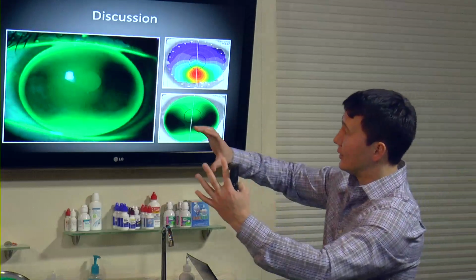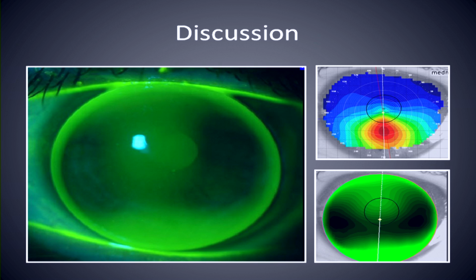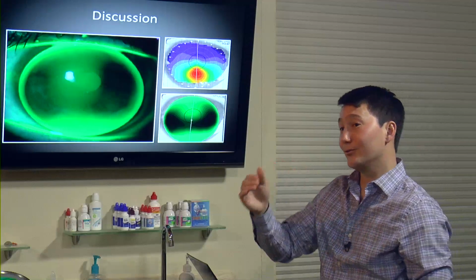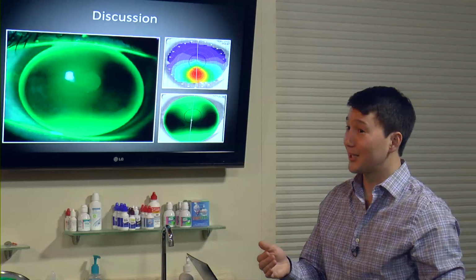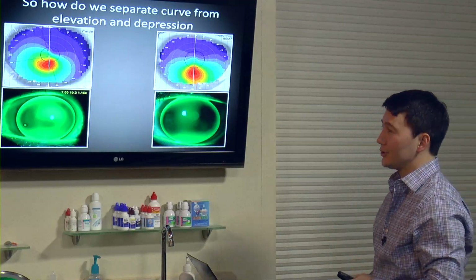So let's put on the actual lens and drop it on this eye. Same lens we designed in the theoretical software, and you see the two highest points where our lens bears the most, and where the topographer is red, here where the cone is, this area is where the eye is bending. It's curved, it's red, it's steep, but it's not red, curved, steep coming out. It's red, curved, steep going back toward the back of the eye. So it's really a valuable thing to understand that axial and tangential maps say the cornea is curved, it's red, it's steep, it's curved, but it doesn't say up or down. And it can be a tricky thing to get your head around.